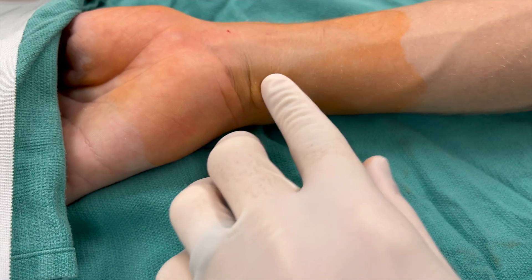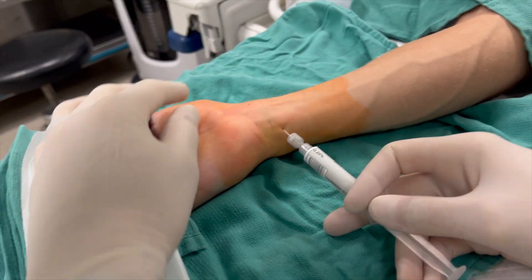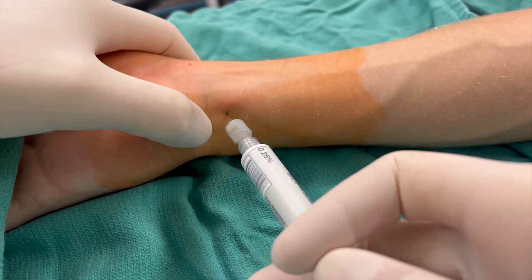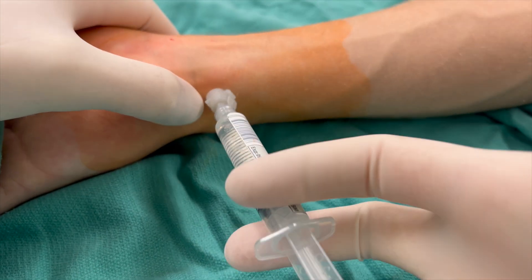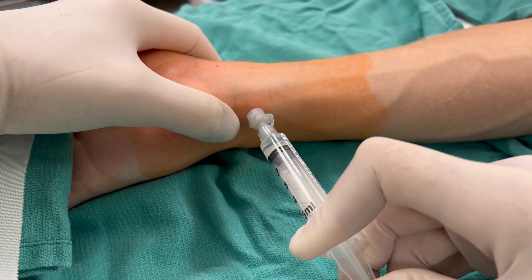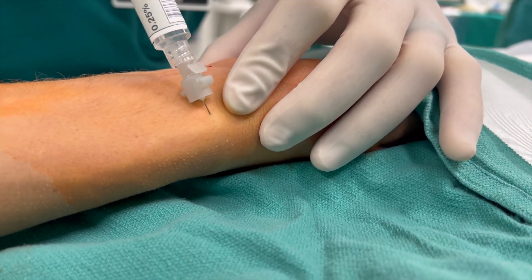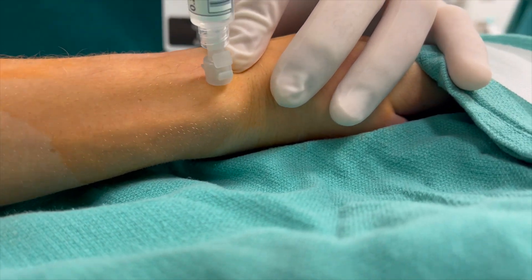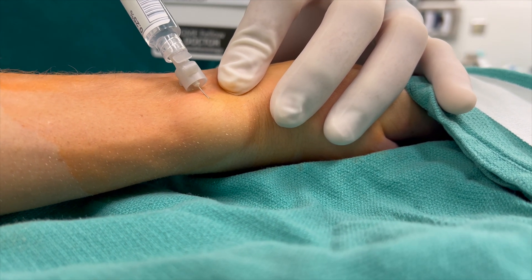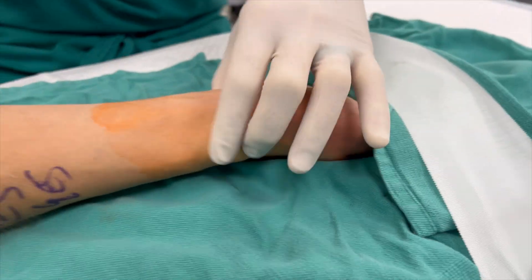For the ulnar nerve, the flexor carpi ulnaris tendon is palpated — it's the most medial tendon palpable on the wrist crease. A needle is slipped beneath this tendon to a depth of half to one centimeter. Aspiration is important here as the ulnar artery is in the same space. After negative aspiration, five mils of local is slowly injected. Finally, for the radial, the radial styloid process is palpated and five mils of local infiltrated subcutaneously. Massage afterwards can help spread the local and accelerate the block onset.